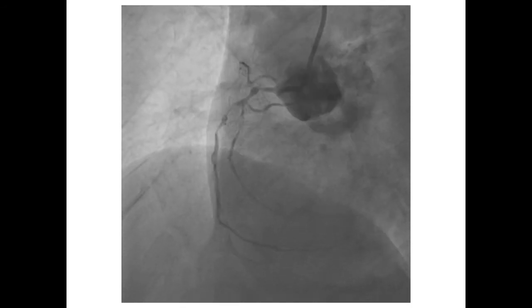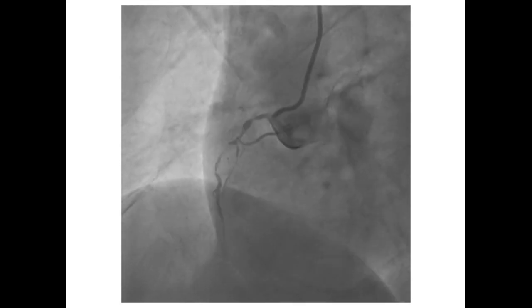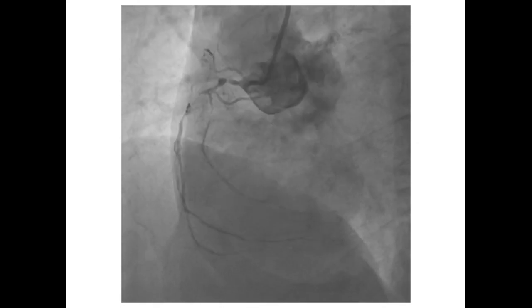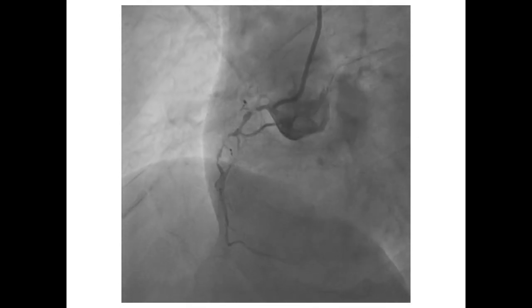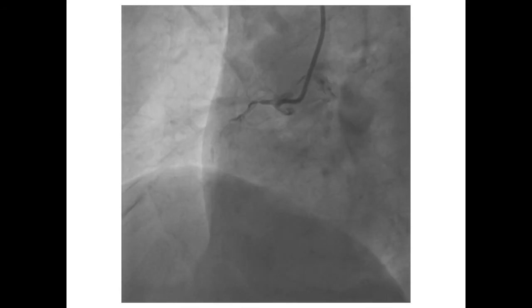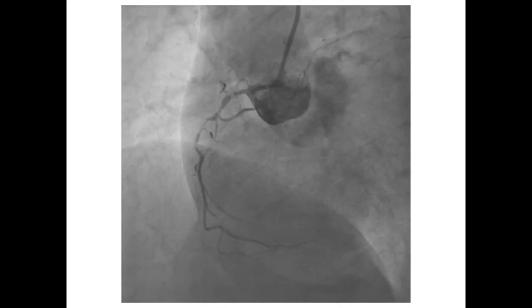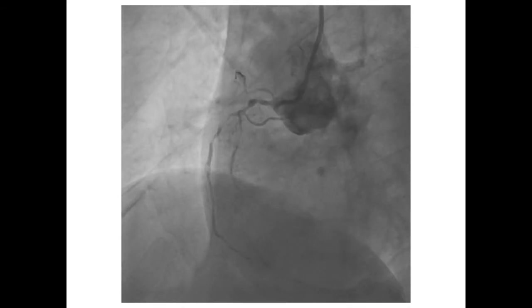This is the angiogram of the right coronary artery. We see an early bifurcating RCA, it's a dual RCA with a large RV branch that shares also the marginal supply of the heart. And of course we knew that this patient is not the ideal candidate for angioplasty, but he was also not an ideal candidate for CABG.